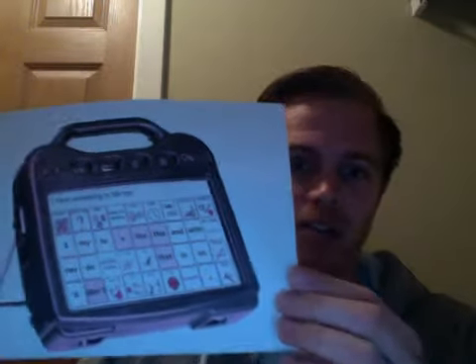But with the technology nowadays, with tablets and things getting smaller, smartphones, it's almost easier just to download an app that has all those same types of software already installed in them. A device like this can cost upwards of $4,000 or $5,000. I think the child that I was working with, his cost about $5,500 for this piece right here.